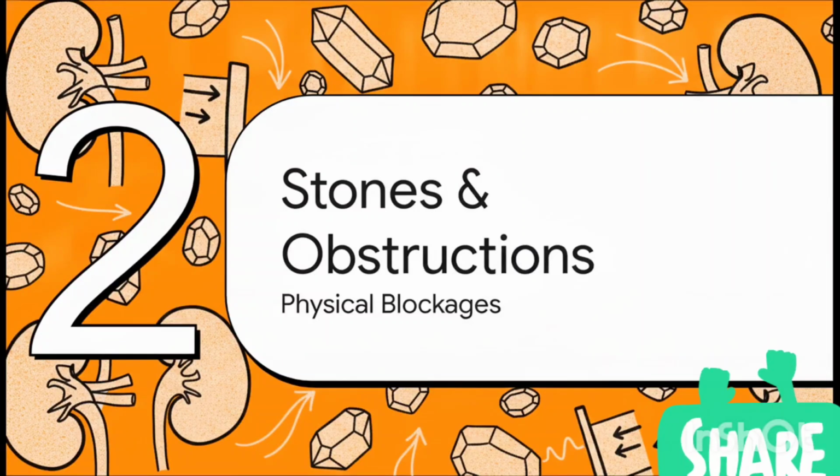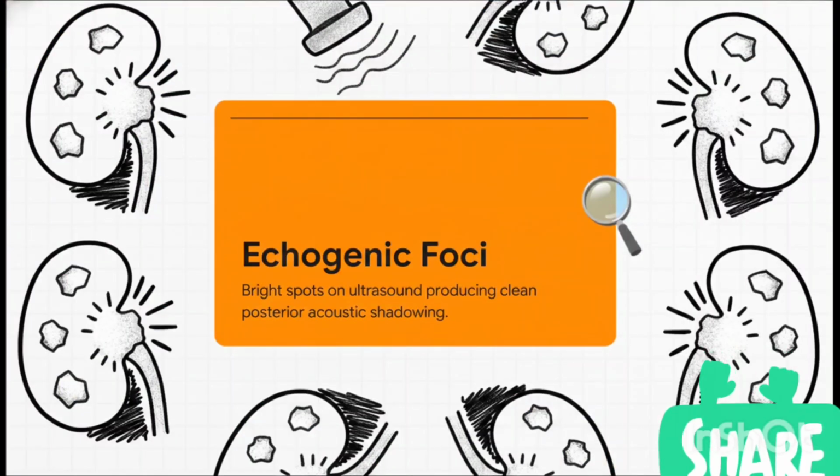Moving on to Section 2. Stones and obstructions, the physical blockages. Now we're shifting our focus to see exactly what happens when there are acute physical disruptions to this finely tuned system. Probably the most common physical disruption is the infamous kidney stone, known medically as a renal calculus.